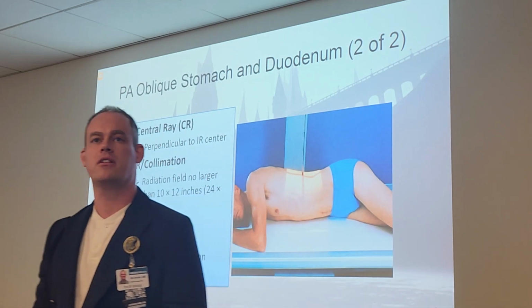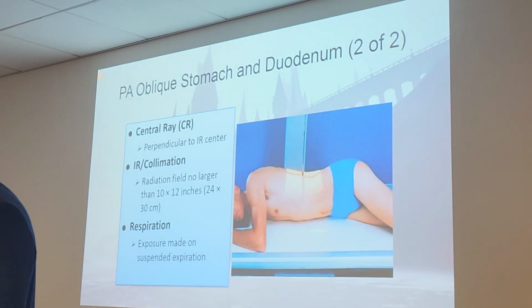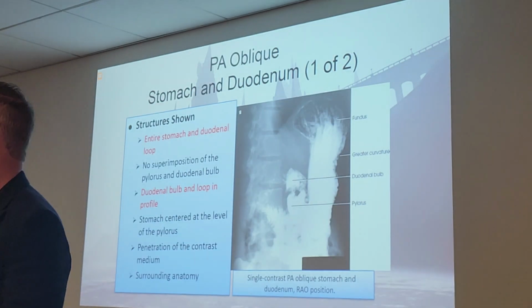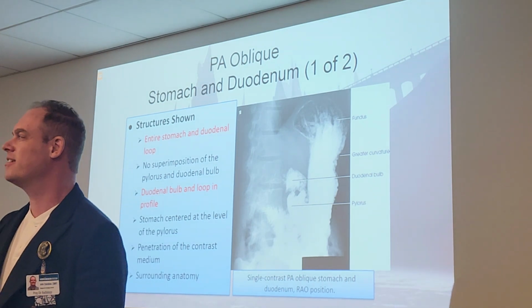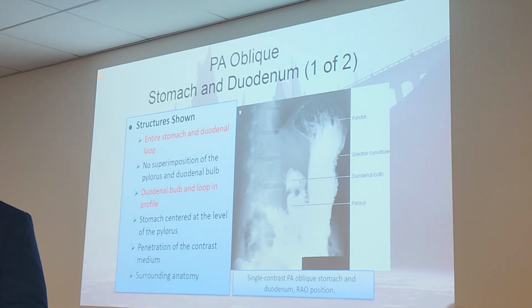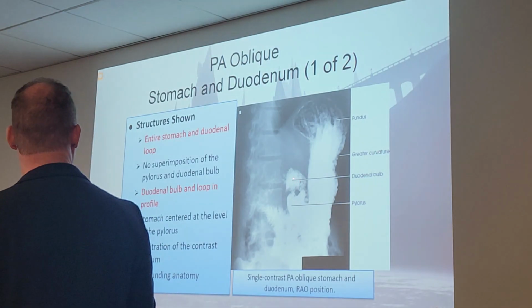All right, so it's perpendicular central ray. We're still suspending at the end of expiration. That has not changed. And who's the star of our show again, guys? Entire stomach, duodenal loop. But for this one, particularly the PA oblique, the RAO, we want the duodenal bulb and the loop in profile, which is what we see right here.